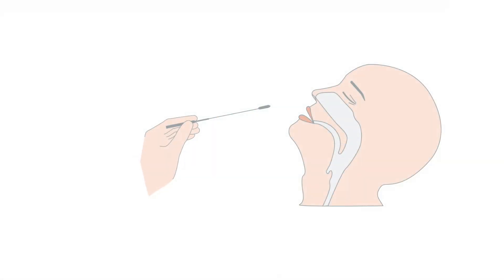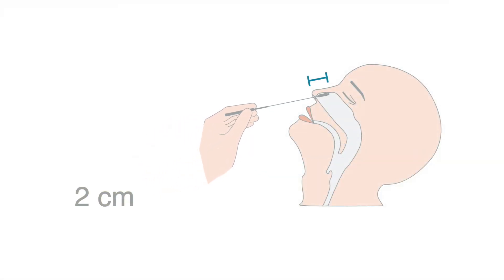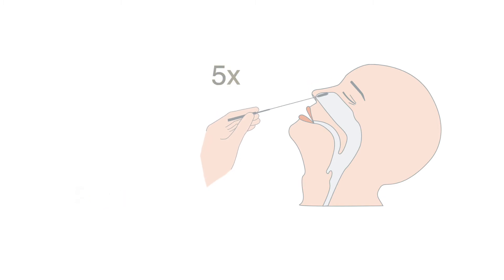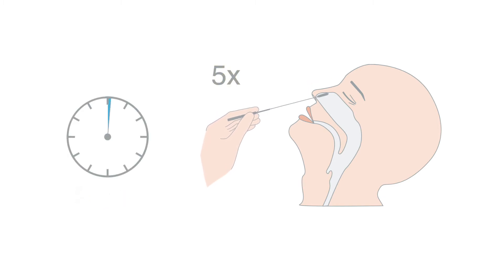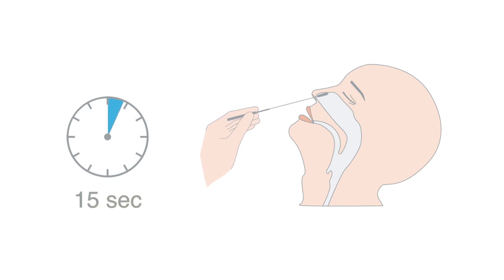Insert the swab approximately 2 cm into the nostril. Rotate the swab 5 times back and forth and press it gently against the nasal wall. Do this for about 15 seconds.